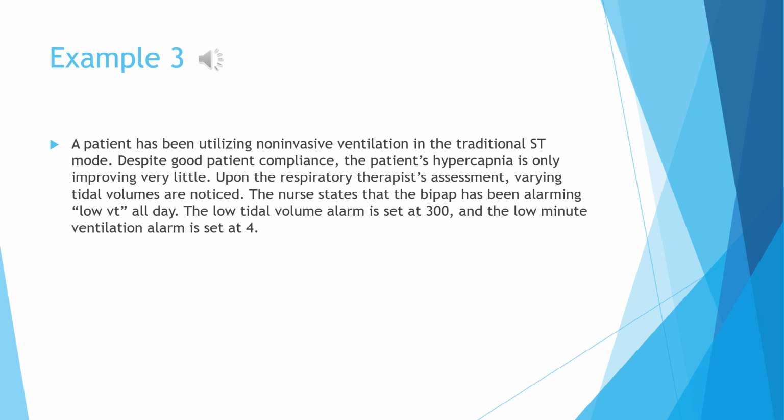Since AVAPS will titrate IPAP while the respiratory therapist is away from the bedside, AVAPS would ensure better ventilation of this patient and an improvement of arterial blood gases.